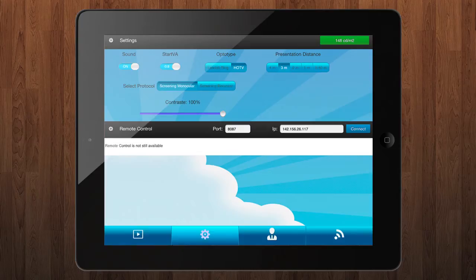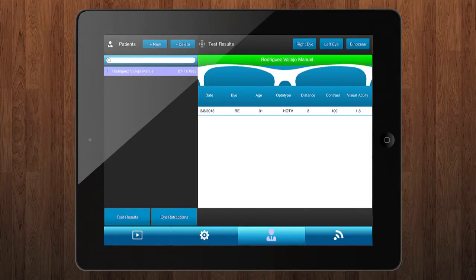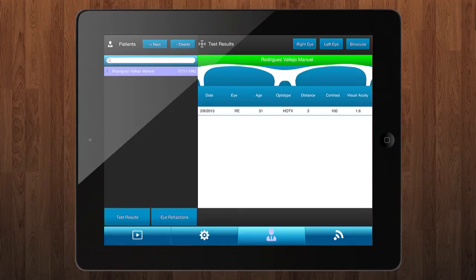Once you have decided the test settings, it's time to manage your patient's database. By this screen you can control the visual acuity progress in a patient or you can collect data for your research.